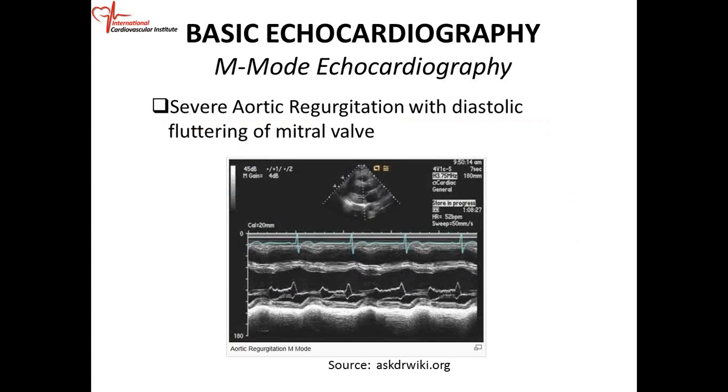Okay? All right. Now, when you look at this M mode, this is the cursor, and the structures that the beam is passing through: first you have the chest wall, the pericardium, the RV wall, the RV cavity, the septum, LV cavity, and it crosses across the mitral valve.